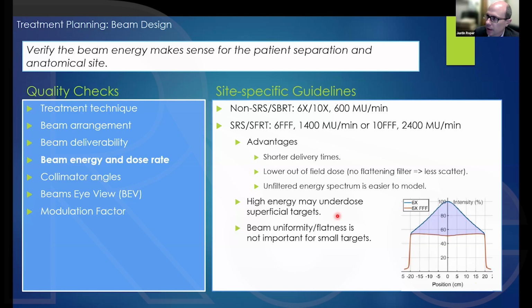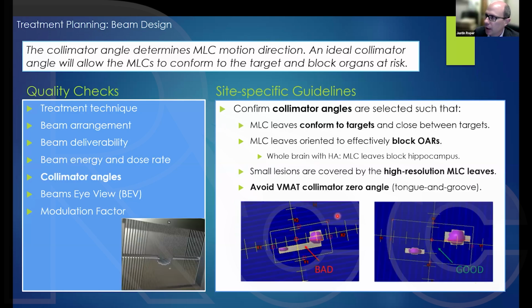And a follow-up question is regarding using IMRT. What is your recommended dose rate to avoid the point where the MLC has to move so fast that it may result in poor patient-specific QA? Yeah, I don't know if there's a rule of thumb or a mathematical formula for calculating that, if I'm being honest. I'm not sure. At Emory, we go as fast as possible. I was just going to say that just try it. You're going to know when you do the QA. That's when you're going to see that what was planned is not what you're getting, right? You're going to see a lot of failures.